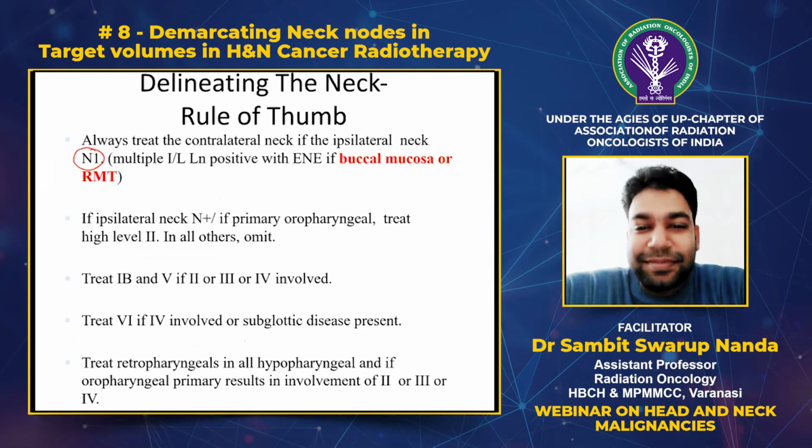So coming to the conclusion and the kind of a summary, rule of thumbs while contouring the nodal CTV. One needs to always treat the contralateral neck if ipsilateral neck is N plus for all the tumors, except in case of buccal mucosa and RMT tumors, where contralateral lymph node is only to be contoured when there are multiple ipsilateral lymph nodes and they have ENE.